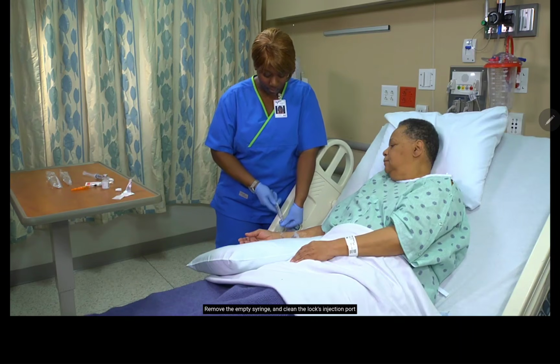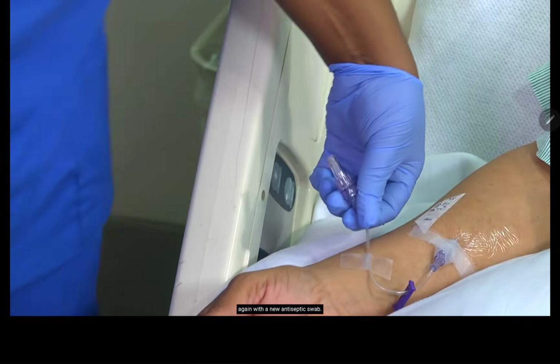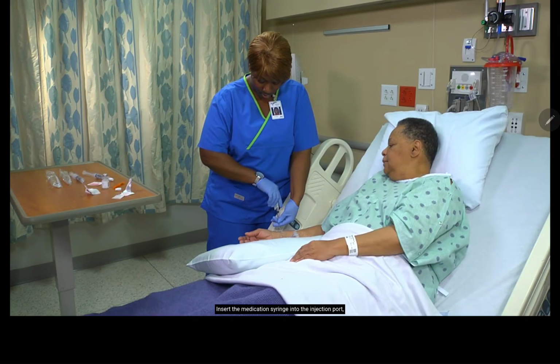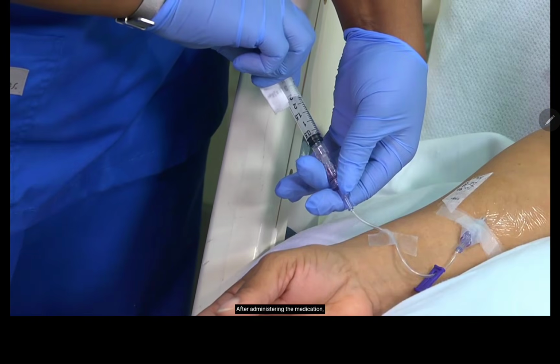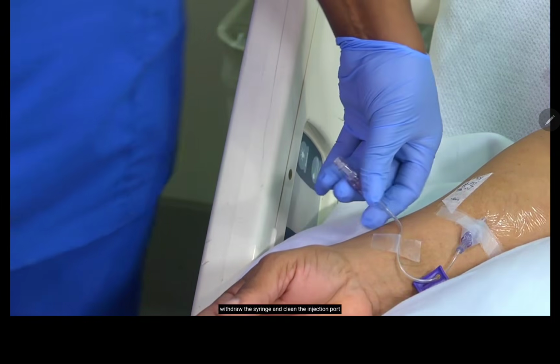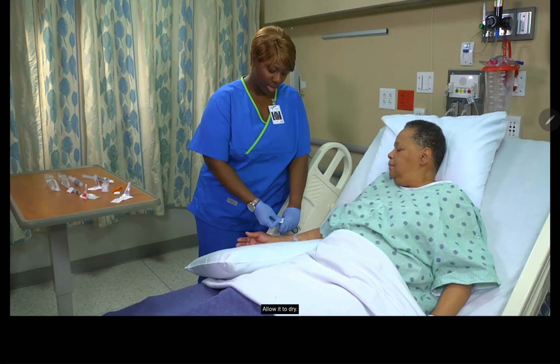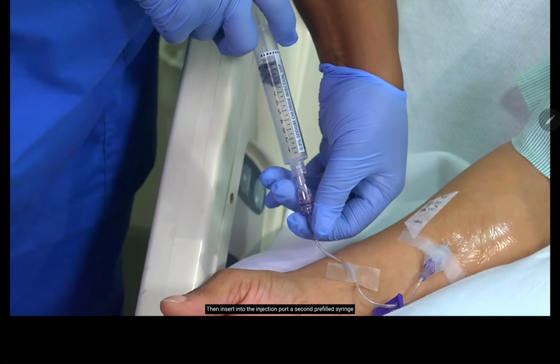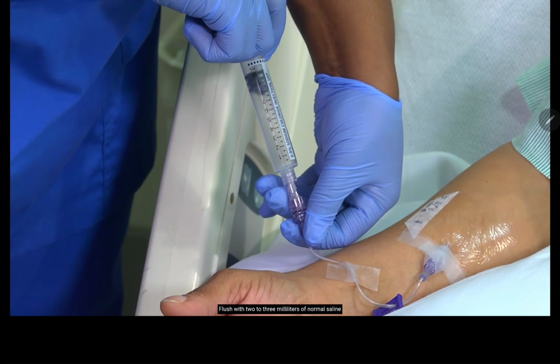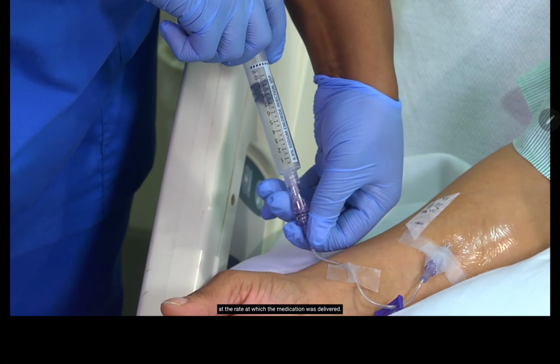Remove the empty syringe and clean the lock's injection port again with a new antiseptic swab. Insert the medication syringe into the injection port and inject the medication within the recommended time frame. After administering the medication, withdraw the syringe and clean the injection port with a new antiseptic swab again. Allow it to dry. Then insert into the injection port a second pre-filled syringe containing normal saline. Flush with 2 to 3 milliliters of normal saline at the rate at which the medication was delivered.